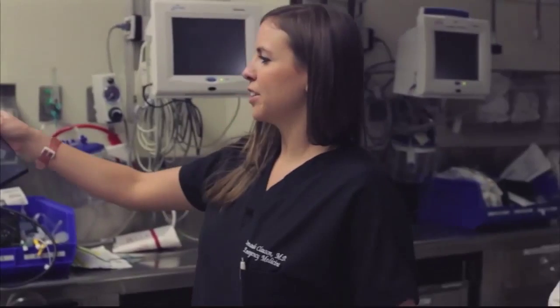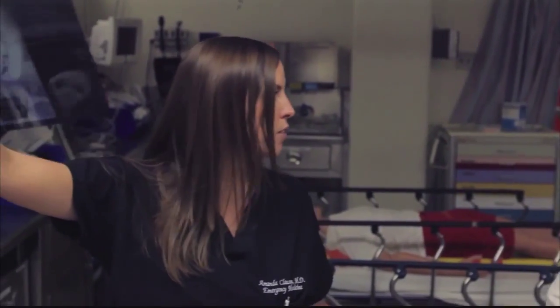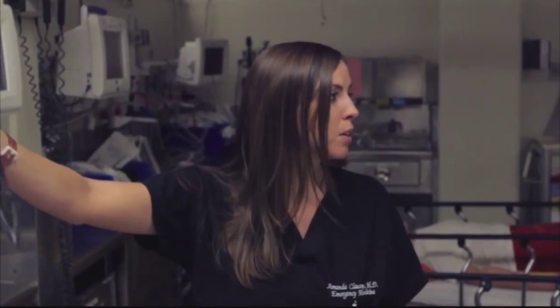head stat. Why is he statting 91%? That is a very good question, Dr. Claudius. Let's get a portable chest x-ray. Look, they printed it out so fast. I don't know, do you see anything wrong? Well, the density's a little asymmetric. I'd be concerned maybe about a foreign body. Okay, that's a good idea. I mean, we don't have a great history. That medic didn't give us a lot of information, so he could have aspirated something when he fell.